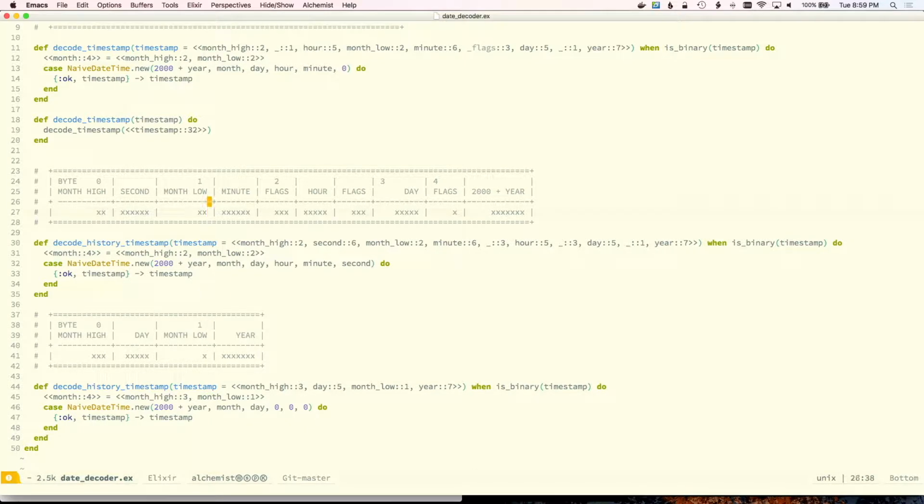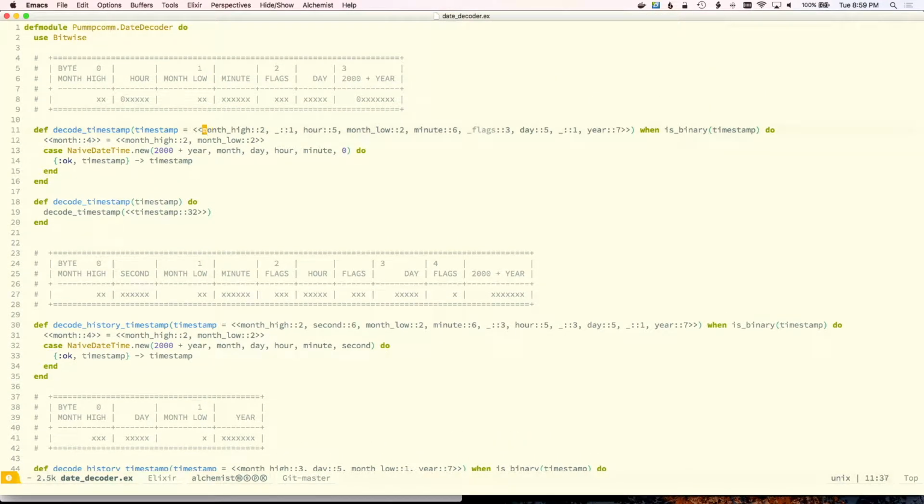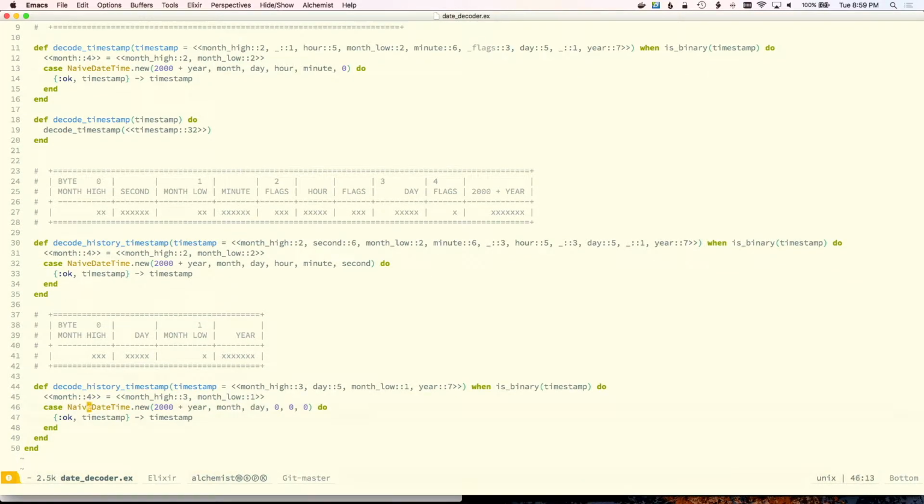All right, so right now I have decode timestamp, which is a little bit of a misnomer at this point. This is decode glucose timestamp. So this is the CGM history table and what they look like. And then further down, there's a decode history timestamp, and this is really the history page format. And I'm wondering and kind of hoping that maybe this is the same thing. But these things only take up 4 bytes, so I'm pretty sure I'm making a new thing here. And I'll just call this full time.